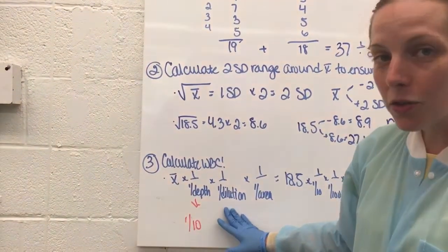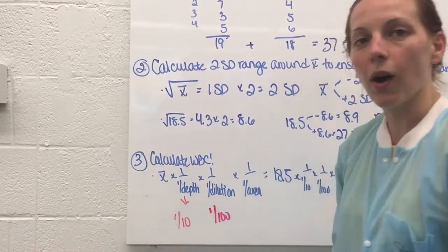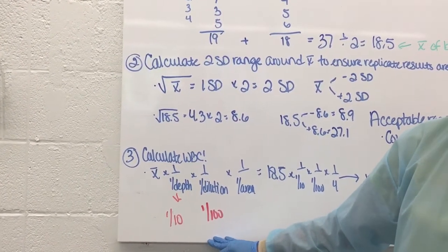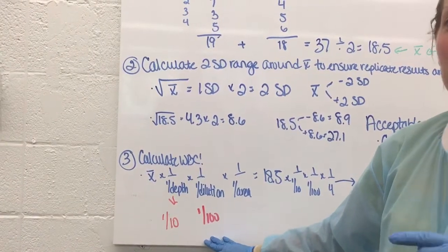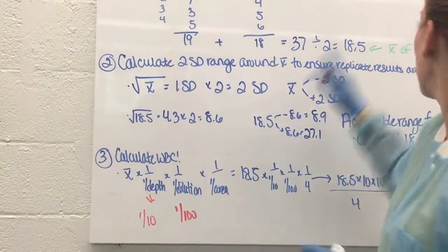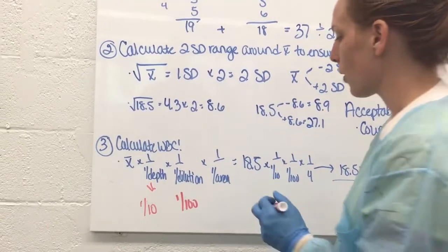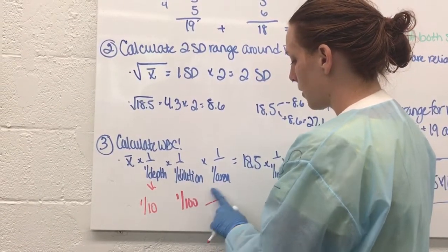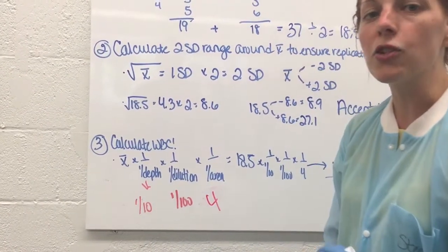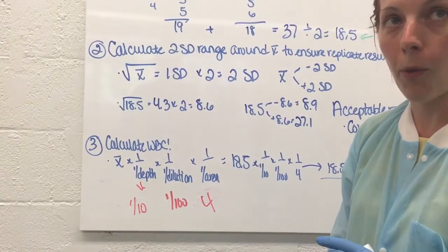Our dilution will change, but we know that in this procedure, our dilution was 1 to 100. Whatever kind of problem you're doing for this class, I will give you whatever the dilution is. But next semester, you guys will have to calculate your own dilutions. The area that we count is dependent on the squares that we count, but we'll go through all of that when we do the hemocytometer worksheets. In this case today, we counted a total of 4 squares, and each square is 1 square millimeter. So 1 times 4 is a total of 4.